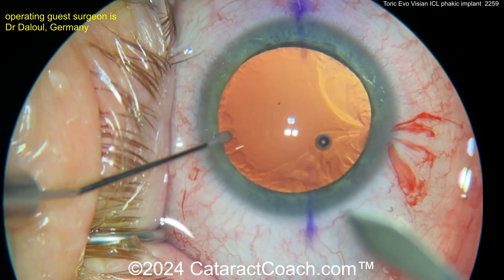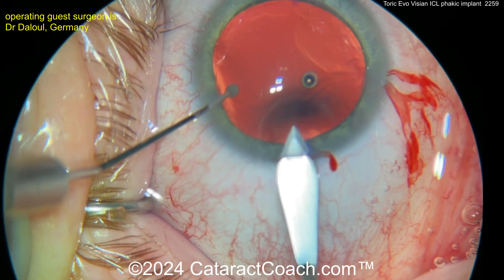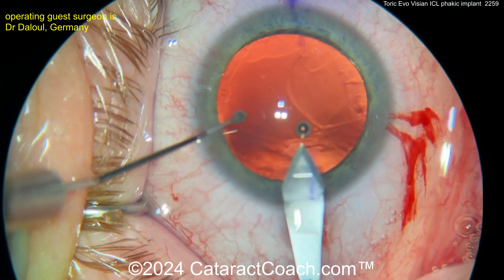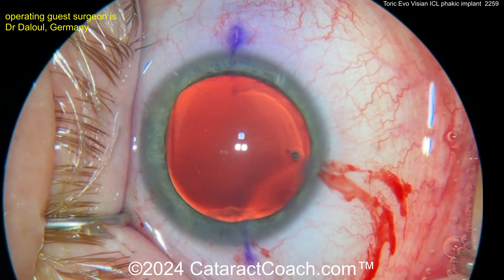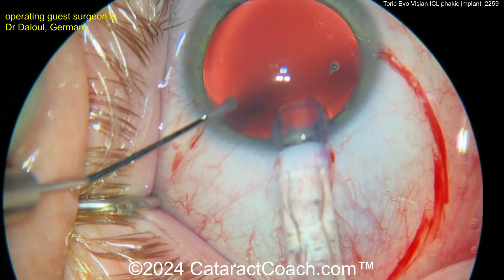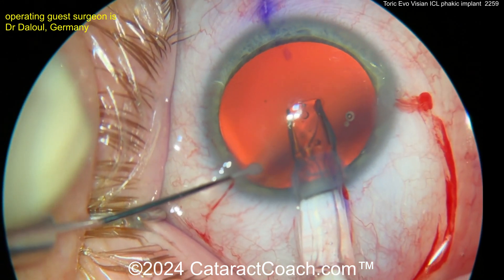Now here's the main incision. The Toric ICL is already loaded and you just place it in the eye. The lens has toric marks, and you're going to line those up with the marks you've made on the cornea. There's good planning software available from the company that helps you choose the correct power, correct toricity, and also how to choose the correct sizing.